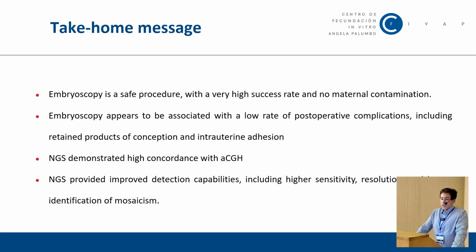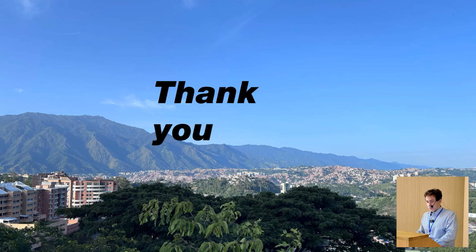And the take-home messages are that embryoscopy is a safe procedure with a very high success rate and no maternal contamination. Embryoscopy appears to be associated with a low rate of postoperative complications, including retained products of conception and intrauterine adhesions. NGS demonstrates high concordance with ACGH, but NGS provides improved detection, with higher sensitivity, resolution, and better identification of mosaicism. Thank you.